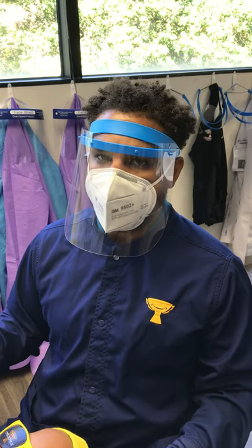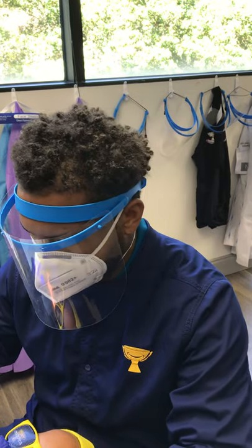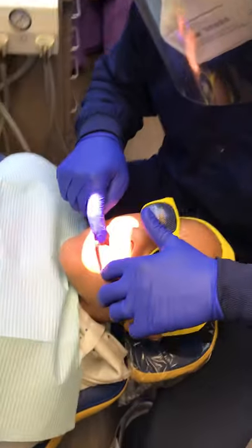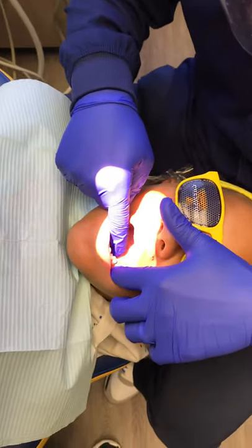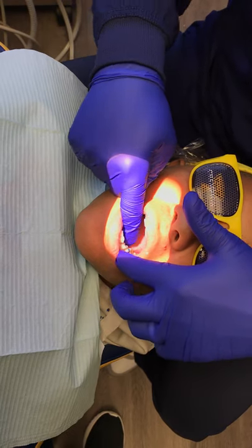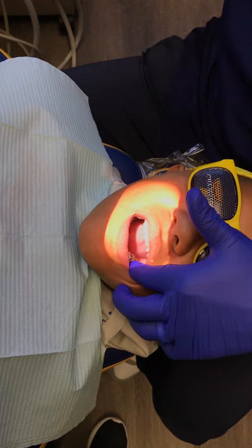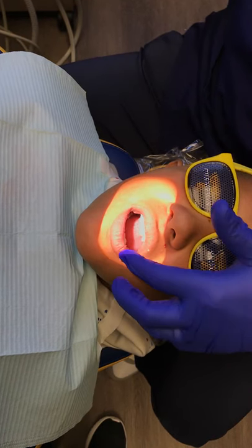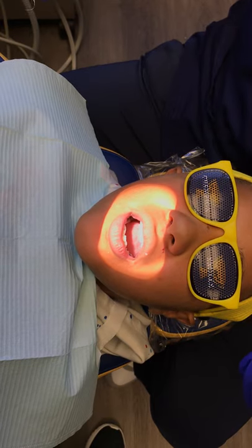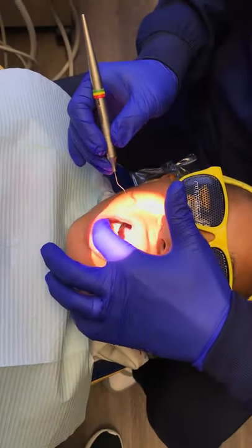With brackets it's only on the labial surfaces — right along here all the way along the gum line. You're also going to get the lingual surface as well as the buccal surface. That's already been done. We don't etch the molars when we're putting bands on, because we want the bands to come off. If you etch the bands, then good luck getting your band off once you put the cement on. So you only etch the teeth where the brackets are going.